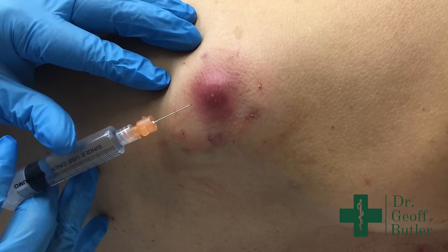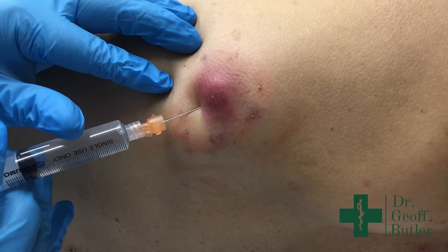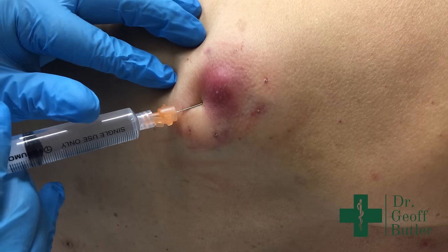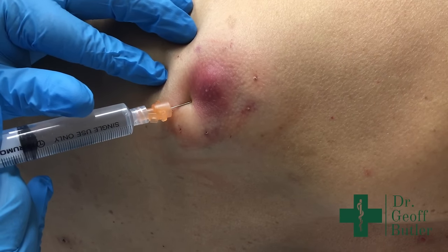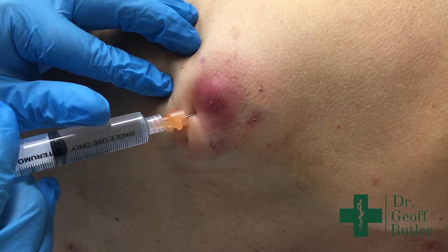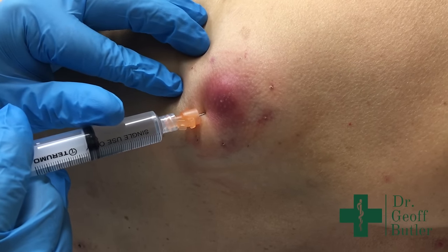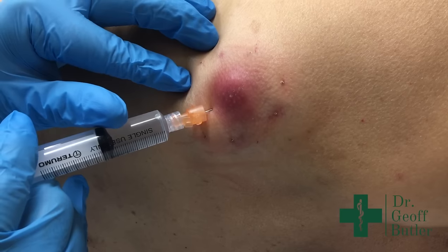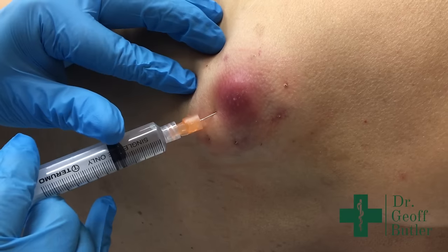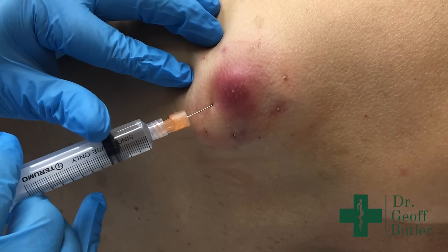You're going to feel a poke here, Tom. Does that hurt there, Tom? No. Now I'm trying to get just underneath it. I don't feel a thing. Good. So that's a good sign that we might be fortunate here and I'm wide enough out that this will take. But that's why when you see other videos, especially ones done in the emergency setting, don't be too quick to criticize the person doing it — sometimes you just cannot get the freezing in when it's infected.